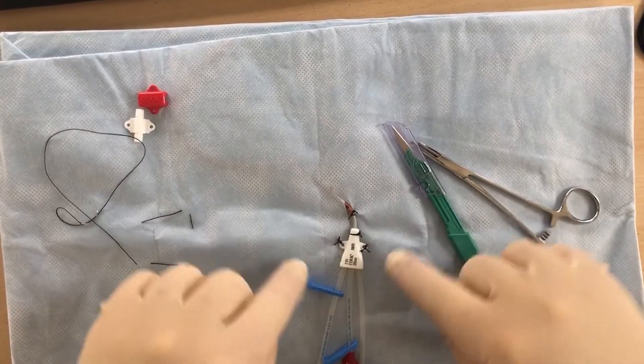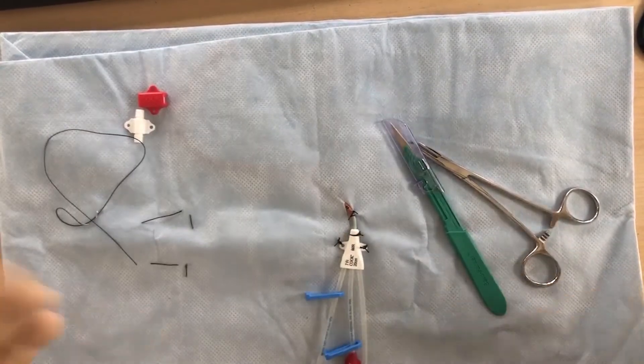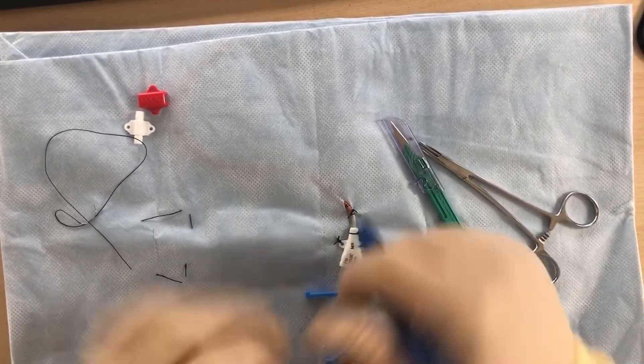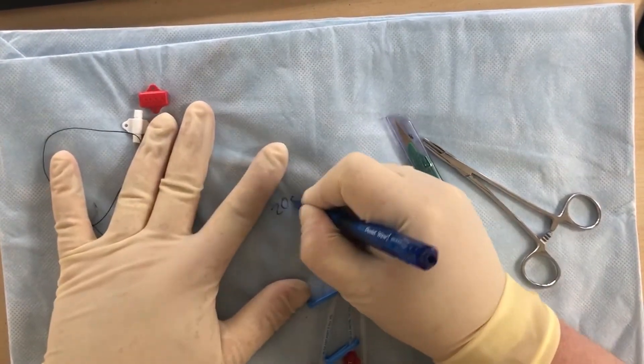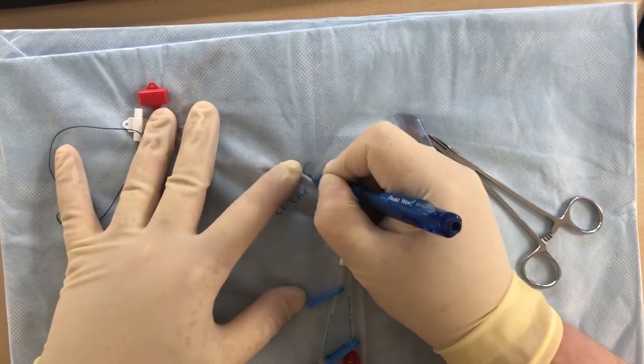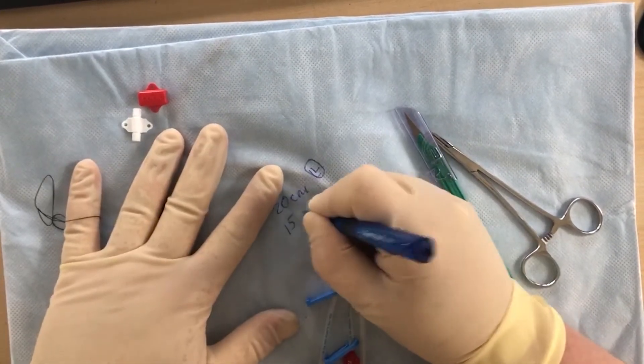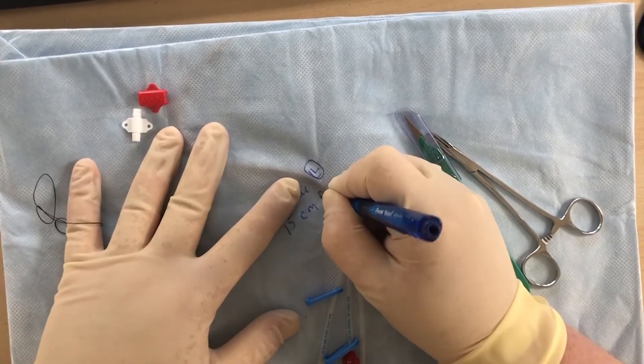This is the proper way to secure a triple lumen catheter in at least three points. When selecting a catheter, you want to choose the 20 centimeter catheter — it'll go on the left side so it can go across the innominate into the vena cava. When selecting the right side, you always want to select a 15 centimeter catheter.